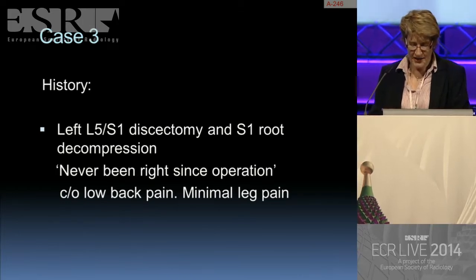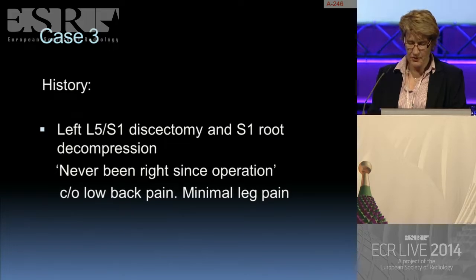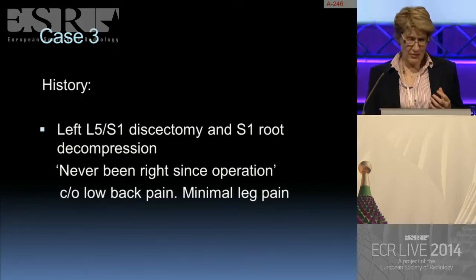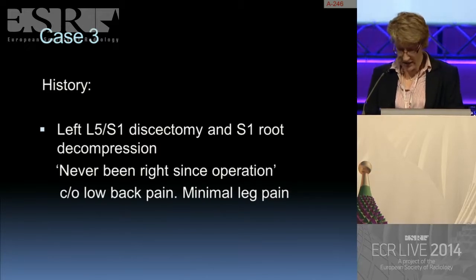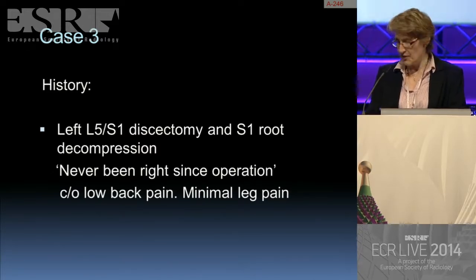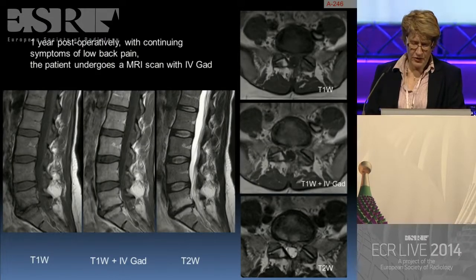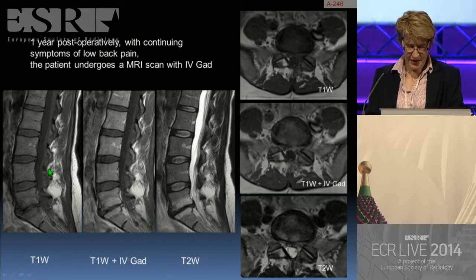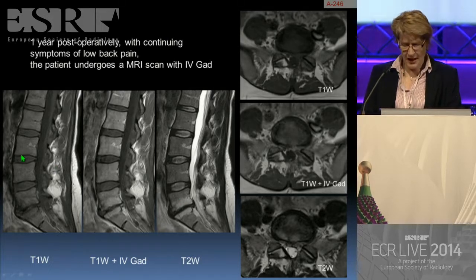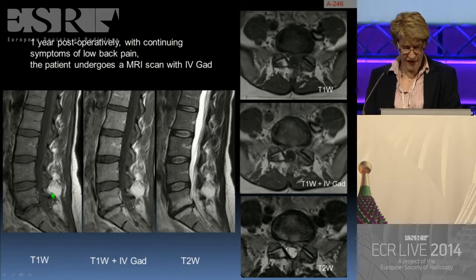Moving on to case number three: this patient underwent a left-sided L5-S1 discectomy with decompression of the S1 root, but the patient complained they'd never been right since the operation and continued to complain of low back pain with minimal leg pain. After about a year of continuing symptoms, the patient underwent an MRI with intravenous gadolinium.